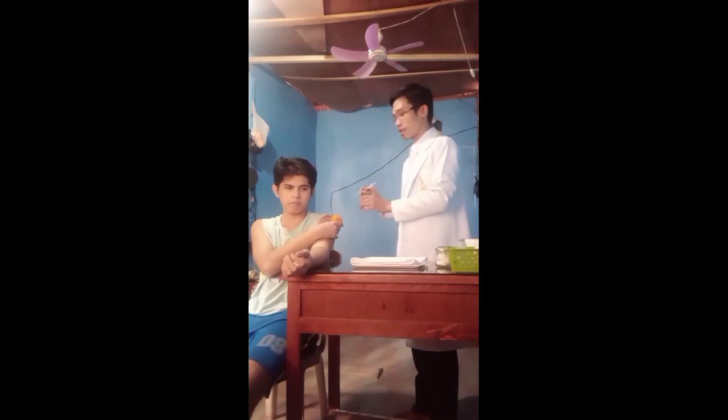If no blood appears, inject medicine slowly to reduce pain, tissue trauma, and chance of leakage of medication back through the needle track. Then smoothly and steadily withdraw the needle and release the skin after injecting.